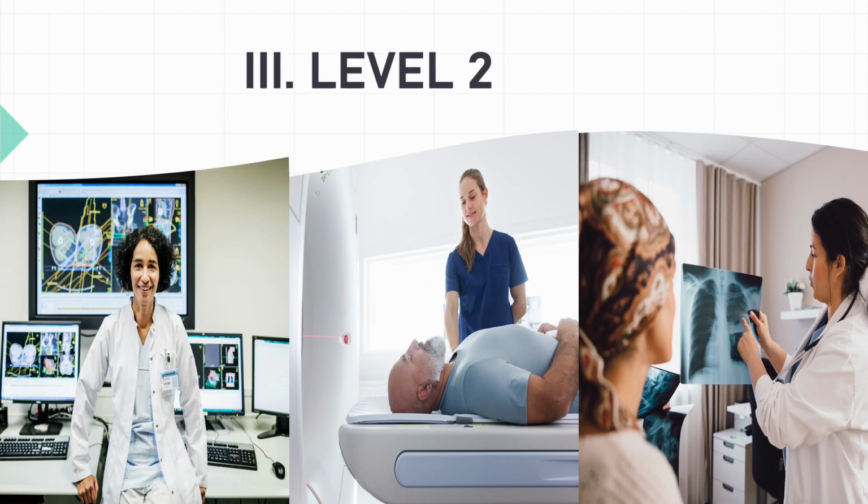Finally, we have the third level, which is Level 2 personnel. This level includes MRI technologists, radiologists, and nursing staff who have been extensively trained in MRI safety. They are well versed in issues related to thermal loading, thermal burns, and neuromuscular excitation from rapidly changing gradients.